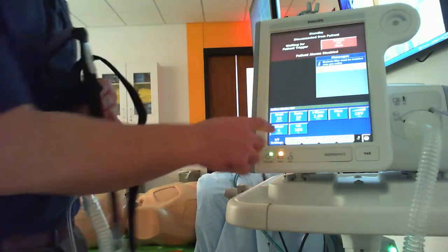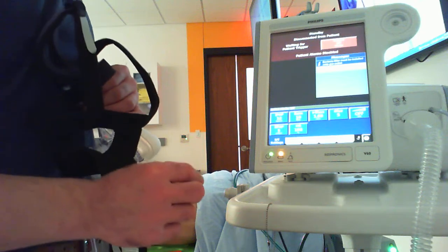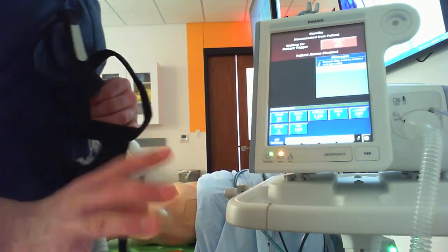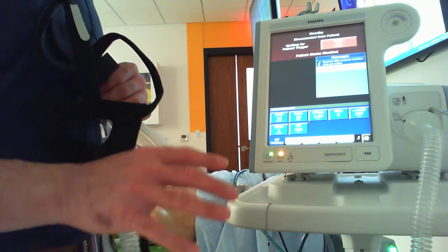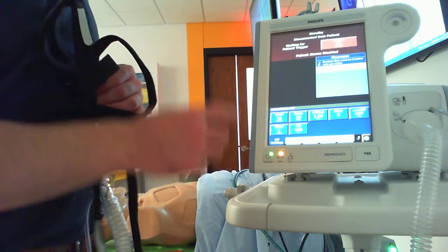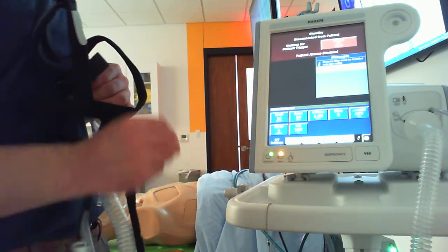Aside from that, for only initial settings, I don't know how much pressure support my patient's going to need. Once again, IPAP minus EPAP, or your inspiratory minus your expiratory, is the true amount of assistance you're giving that patient on inspiration. I typically start out with 4 or 5 centimeters of water as a rough baseline. We're not trying to scare the patient, okay? But we need to know how to quickly adjust that level of pressure support to achieve some clinical goals that should be attained at the bedside.